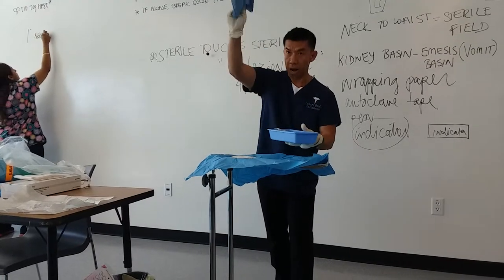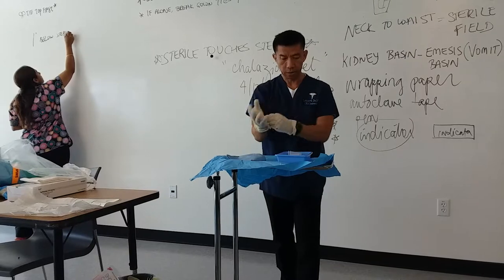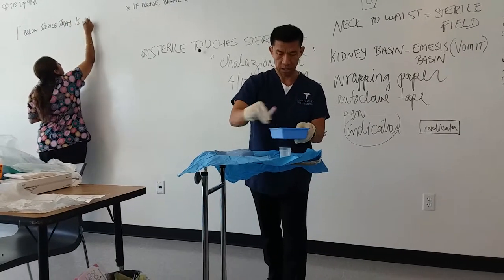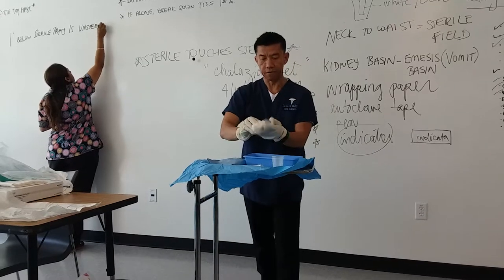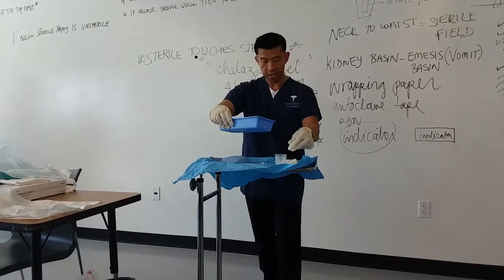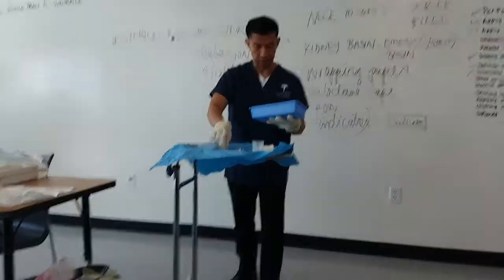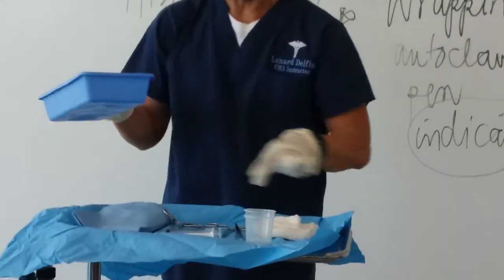I'm going to arrange this. This is my penestrated drape. These are my sterile towels. This is the medication cup. This is my syringe and needles. There are my sponges — we have four-by-four and two-by-two sponges. Then I have my hemostat, needle holder, scissors, iris scissors, and thumb forceps. It comes in the set, so there are four different ones.